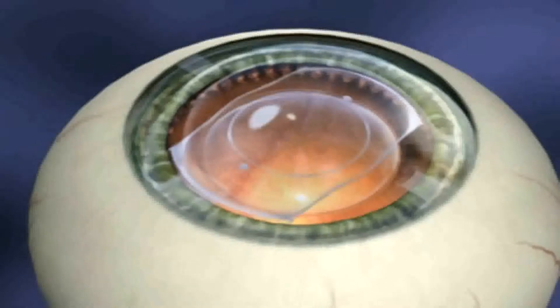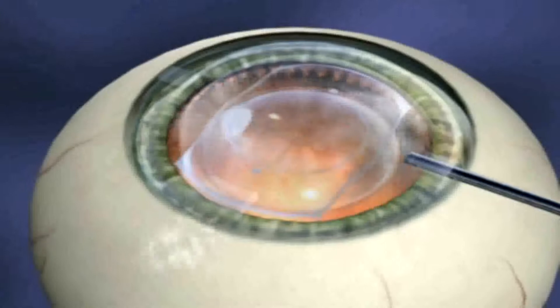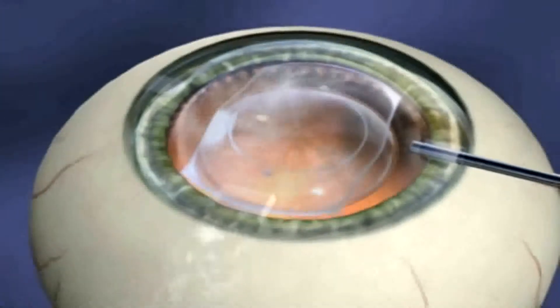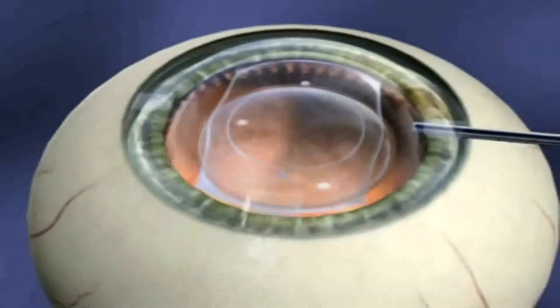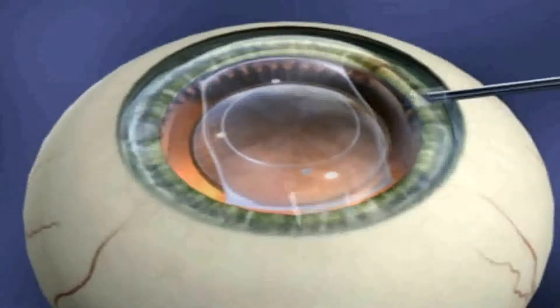Thoroughly remove the viscoelastic by irrigating the anterior chamber with BSS through a 27-gauge cannula with slight incisional pressure. Thorough removal is a critical step to avoid early post-operative intraocular pressure spikes.